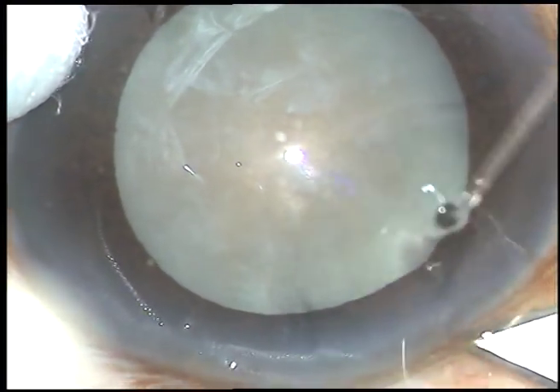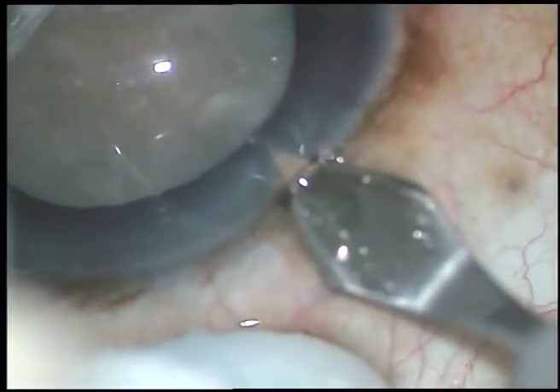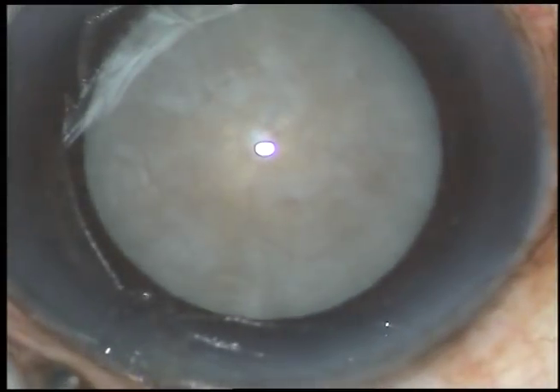Dear colleagues, this is a hard white cataract. Nuclear sclerosis in this case is, I think, grade 4. I have taken up this case for surgery. Let us watch the surgical steps.